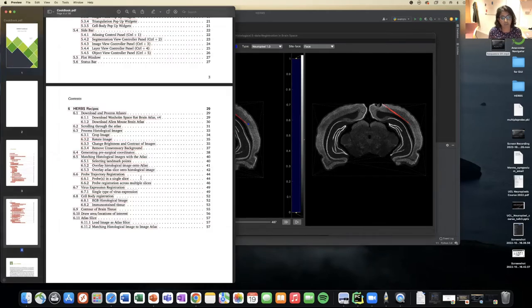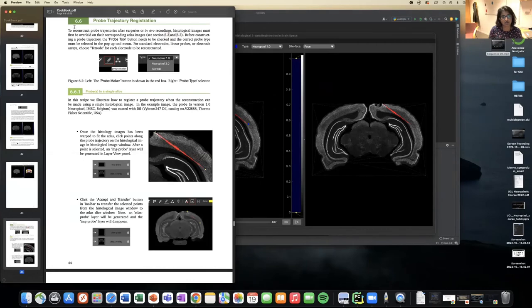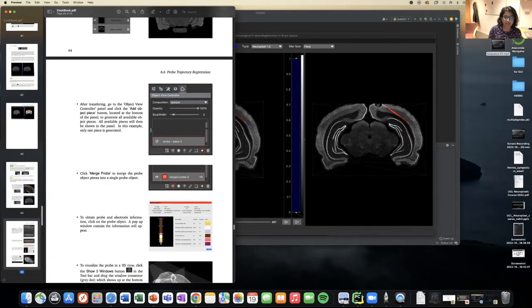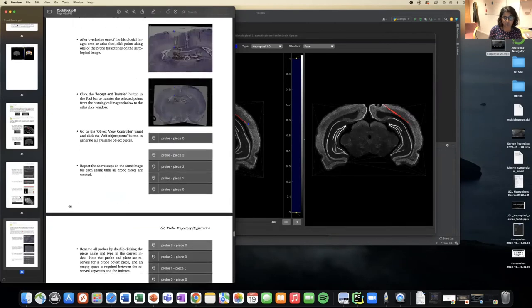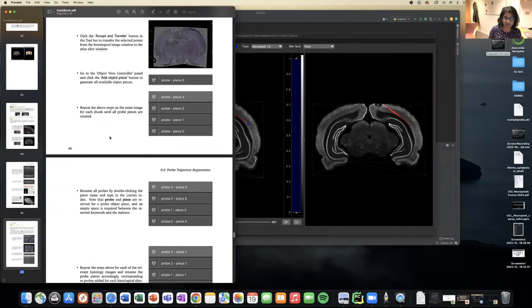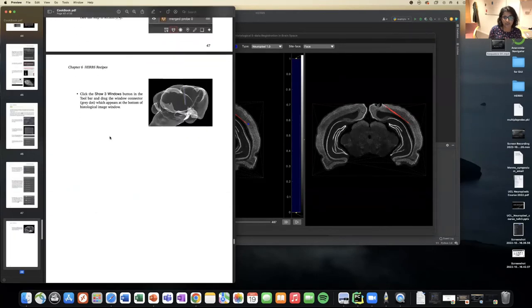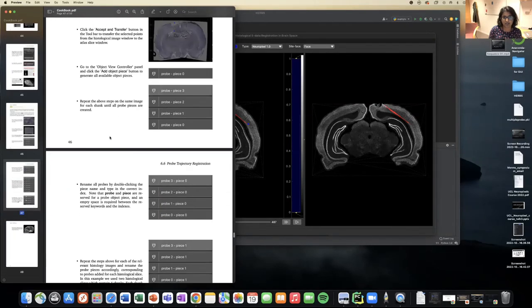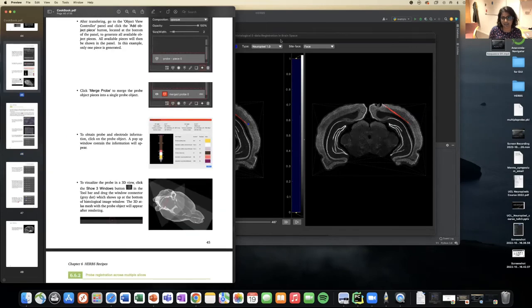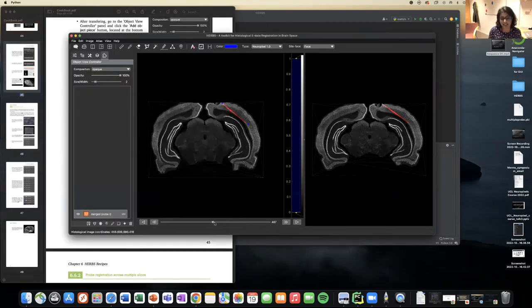This is a coronal section of one slice probe track. But sometimes it's not the case. We have multiple slices with the probe track. So to do that, you go to section 6.6 on our cookbook. And you can see we have both Neuropixel 2 instructions of how to register probe tracks as well as how to go through multiple slices.